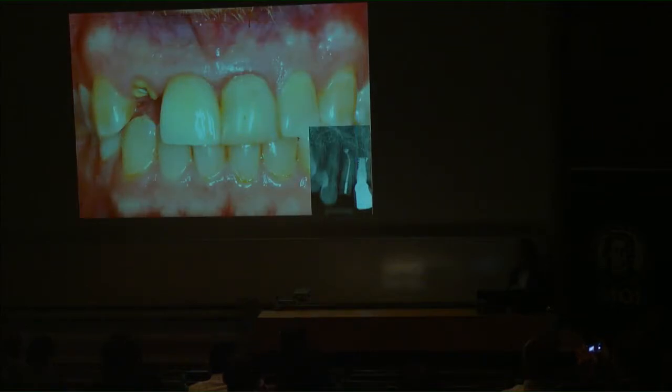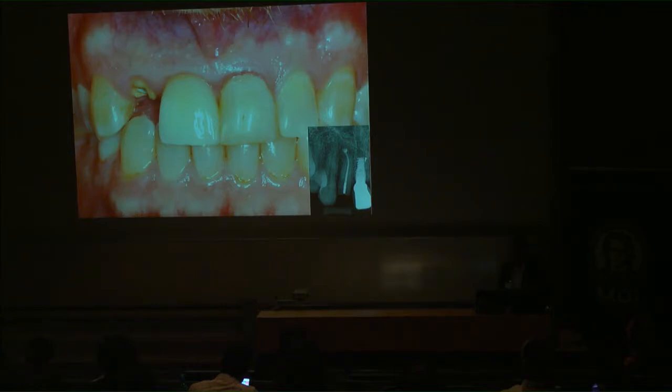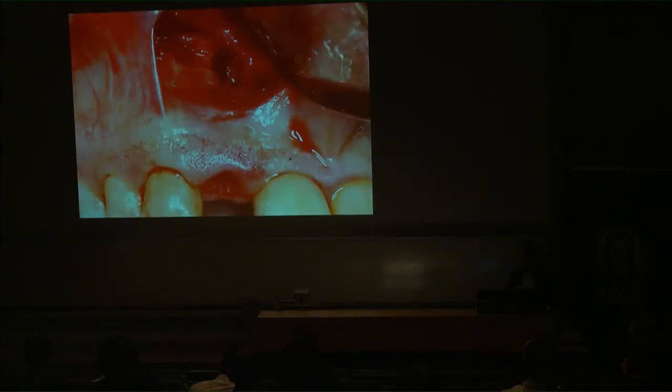Another case, a 48-year-old patient with a fractured lateral incisor. The root was very long and curved with apical granuloma. The adjacent immediate implant was placed 2 years prior. An apical surgery was performed at the time of implant insertion. A mesio-proximal shield was retained with the hope to preserve the bone between the implants.